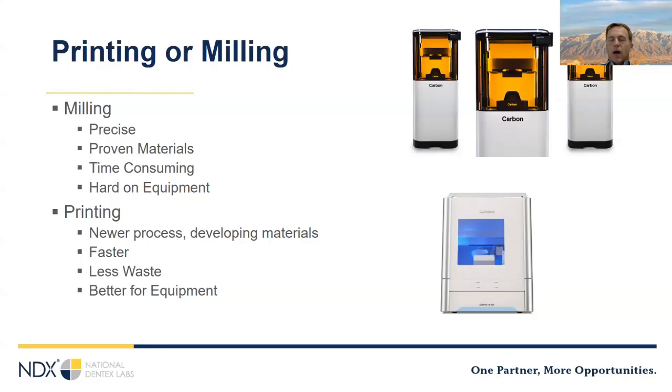It's obviously acrylic that's made in a commercial environment, so it doesn't have flaws, that sort of thing. There's no processing problems. But milling dentures is very slow in the laboratory. It takes several hours to mill 1 arch, and there's no economy of scale. If you do 100 arches, it takes the same amount of time to mill 1 arch.